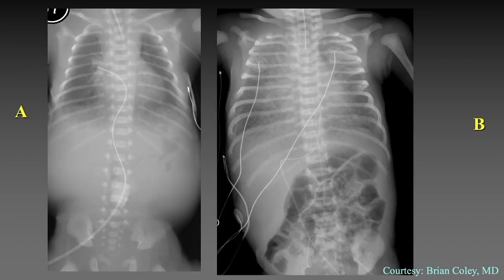UV catheter malposition is common in patients with abnormal anatomy. Patient A has an atrioventricular canal and the UV catheter tip has coursed through the intracardiac defects to reach the right superior pulmonary vein. In patient B, the UV catheter has entered the left portal vein and the tip is in the vertical vein of a total anomalous pulmonary vein with infradiaphragmatic connection to the portal system.